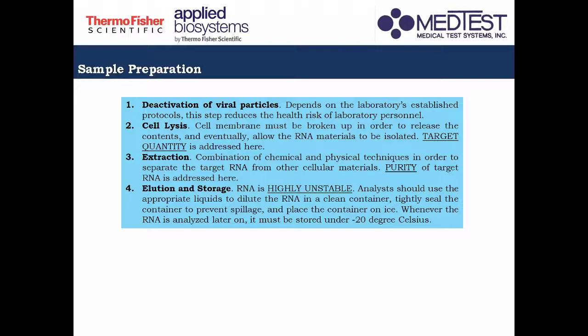What we want is to get the target material, the RNA. So para makuha natin siya ng puro, we do extraction protocols. And in this extraction protocol, purity of your target material is being addressed here.